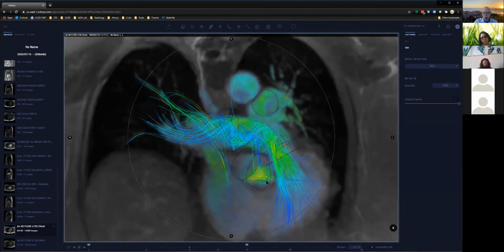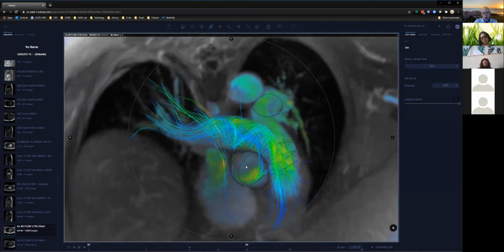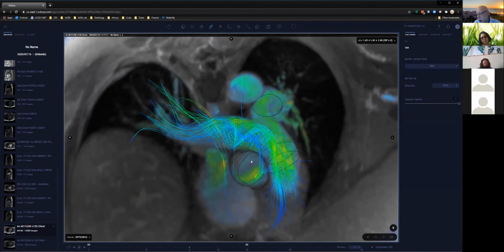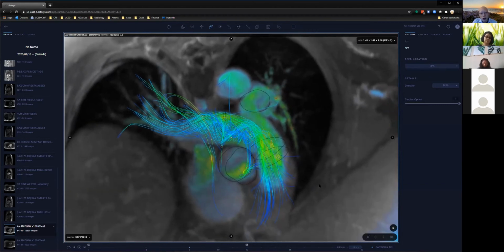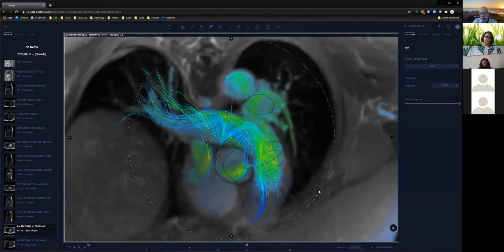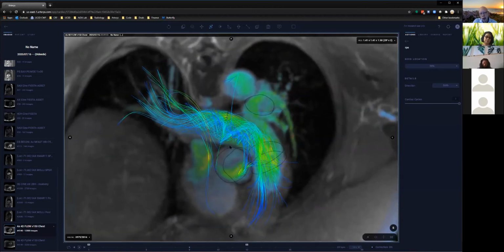One of the papers that we wrote recently was a paper in Radiology: Cardiothoracic Imaging about vortical flow and how to quantify that. When there is a tremendous amount of vortical flow, as you can see here, the flow measurements tend not to come out well. So an important aspect of quantitative cardiac MRI for this kind of thing is to know, when you have many options of where to measure blood flow, what numbers to trust.